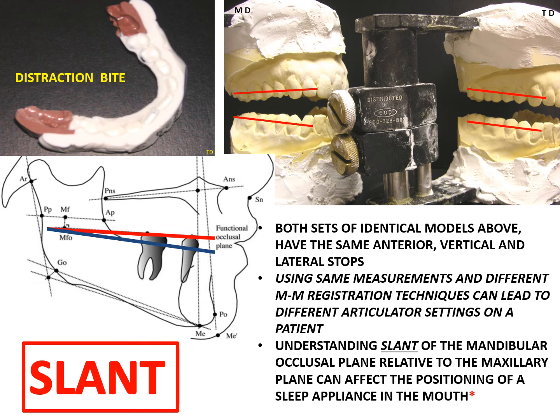The models on the left appear to be masseter dominant, and on the right temporalis dominant. Being able to factor in slant into registering the optimal treatment position is important for clinicians to understand to achieve optimal airway dilation.